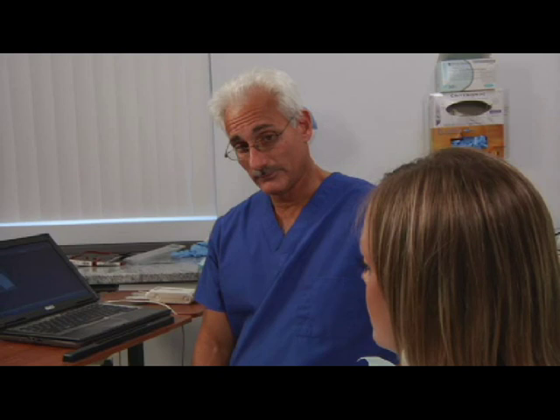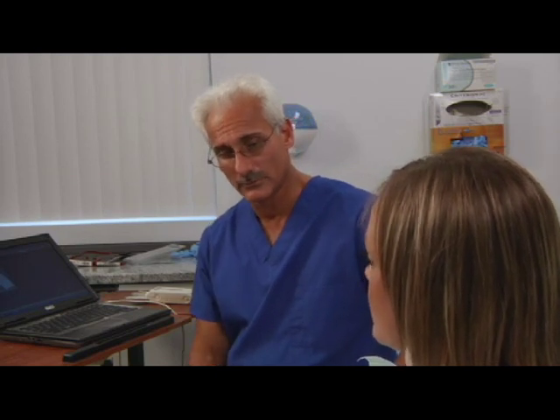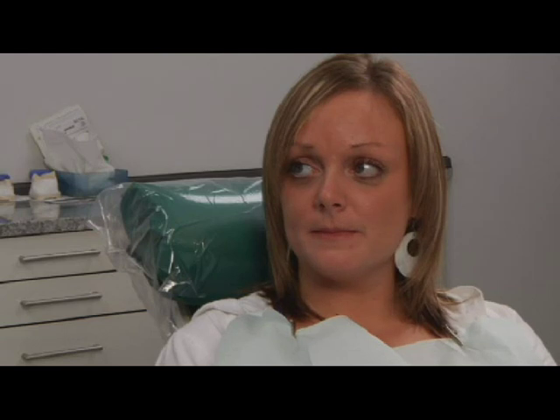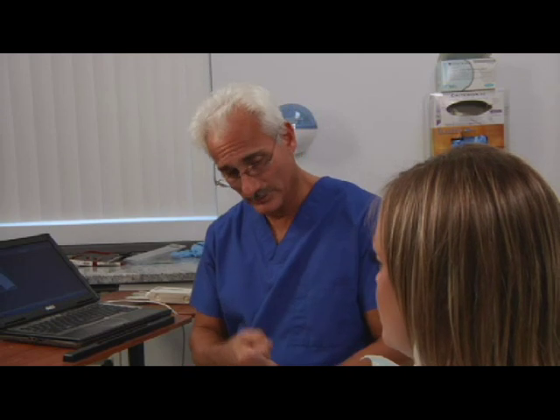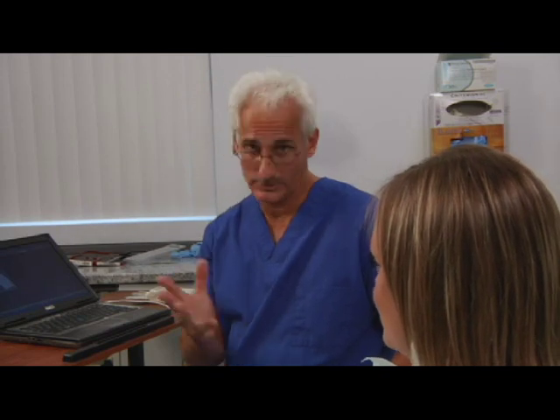Now that we've straightened out your occlusion, what's different about it? How does it feel different from before we treated you? It feels a lot different — it feels good. Definitely aligned better; I can feel it in the back, less pressure. So it feels lighter in the back? Yes. And does it feel like you can close and your teeth fit together? Yes. And did it feel like that before we did this? No. That's one of the advantages of disclusion time reduction — it automatically balances the bite and closure for the patient and speeds up the process of doing occlusal adjustment therapy.